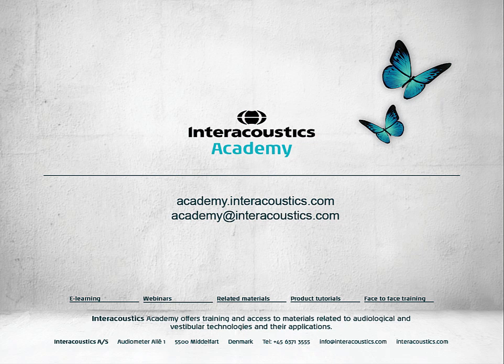This concludes this quick guide video on recording an ECoG displaying the cochlear microphonic.